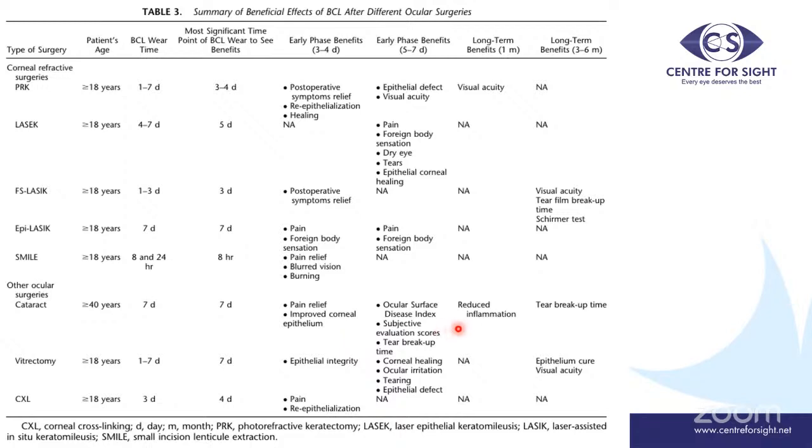Early phase benefits show OSDI index is improved, tear breakup time is improved. Long-term benefits show reduced inflammation and improvement in tear breakup time. Even BCLs can be worn post vitrectomy also.